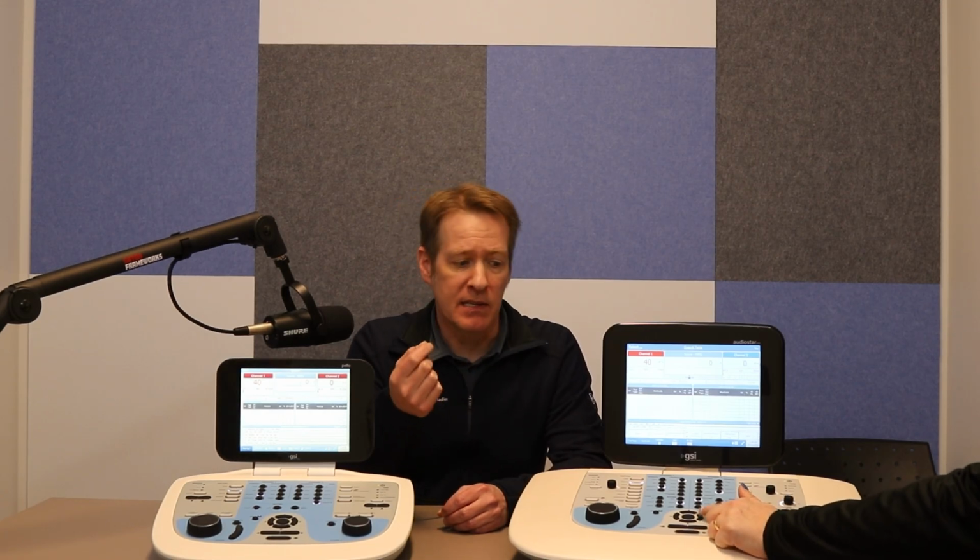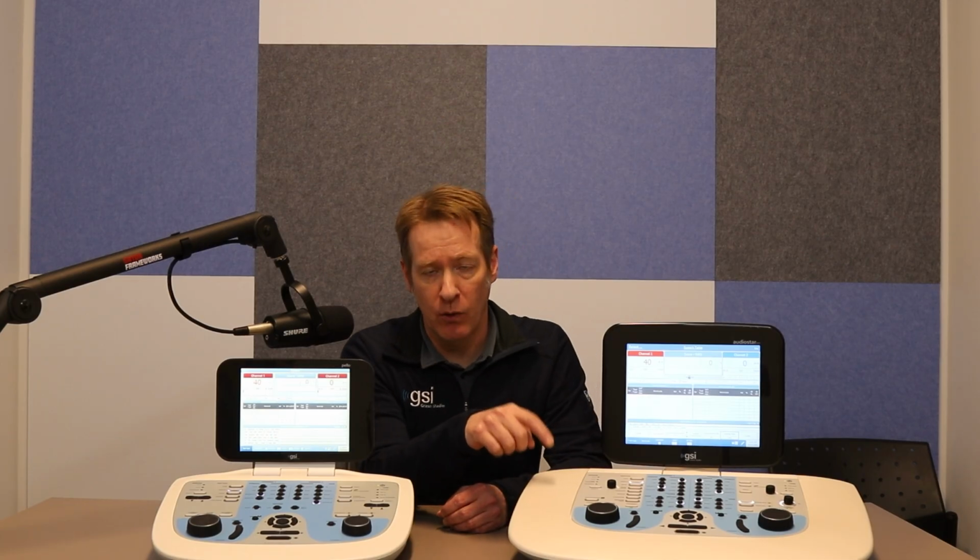And what this means is that when I press the interrupt button on channel 1, it's waiting for me to score the results. So I press the interrupt, it'll play the first word or sentence in the series, and then it's waiting for me to score it before it automatically moves on and presents the next one. We have a couple of different options that you can move on the fly and change.